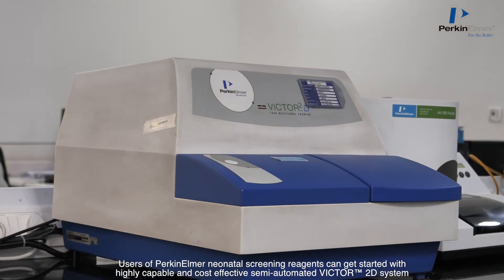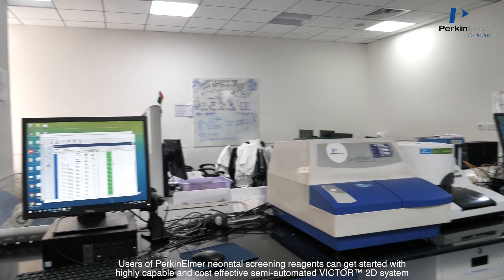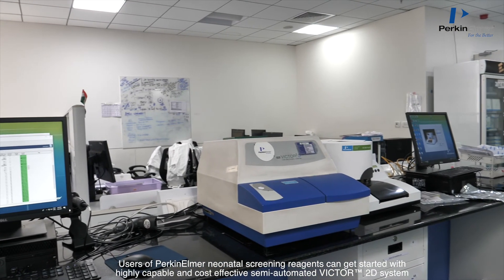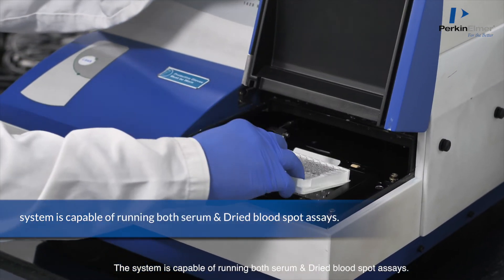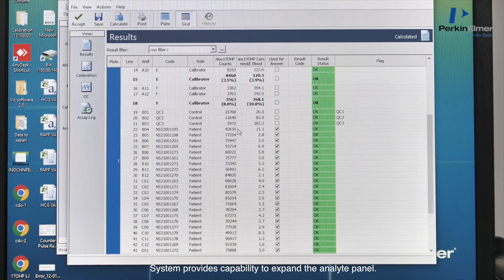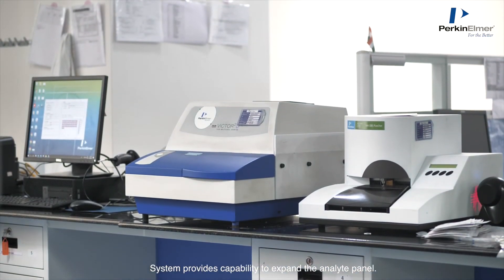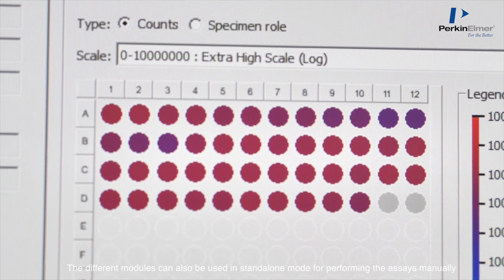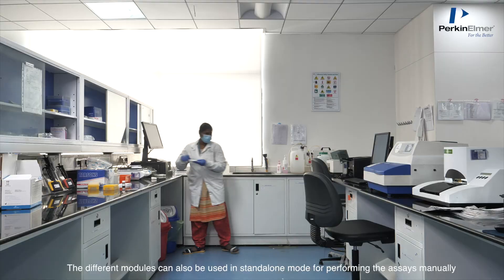Users of PerkinElmer neonatal screening reagents can get started with the highly capable and cost-effective semi-automated Victor 2D system. The system is capable of running both serum and dry blood spot assays and provides capability to expand the analyte panel. The different modules can also be used in standalone mode for performing assays manually.